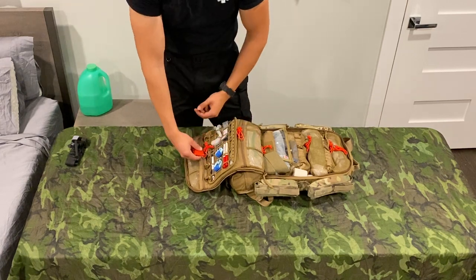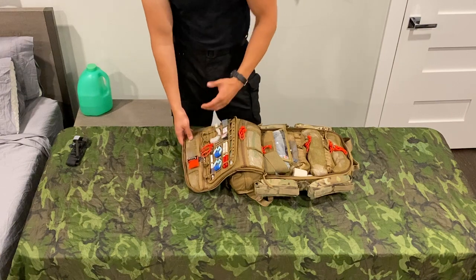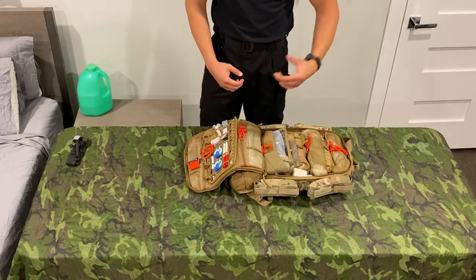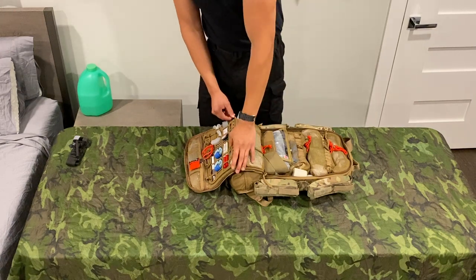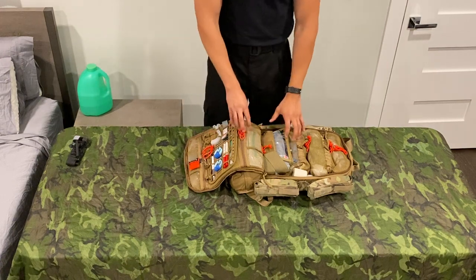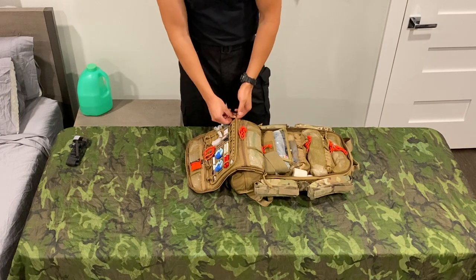I also have another EMS goodie — just a little CPR mask, something light and easy to throw in there. Some of the stuff on the instrument panel isn't directly airway related. We have a Velcro reusable IV tourniquet — it's a little more robust. I do have some of the small ones in my IV kits. We also have a scalpel here for general cutting — just a good sharp instrument. I don't really have the stuff to do a cric in this bag, but it could be used for that if you did have the stuff.